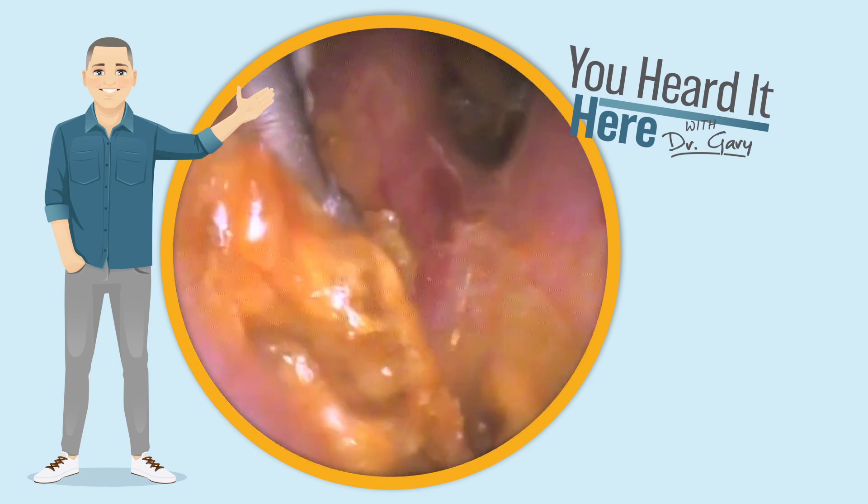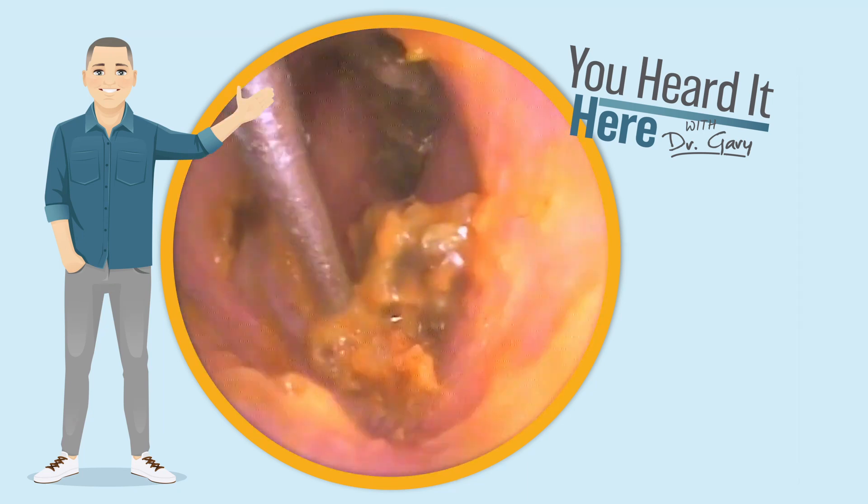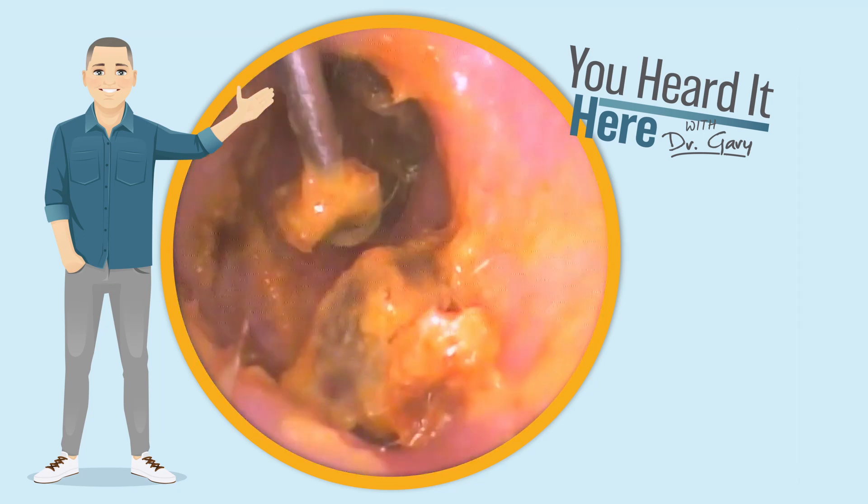It's crazy how different people have different textures of earwax. This stuff was so soft that it became very difficult to get it to stay together.